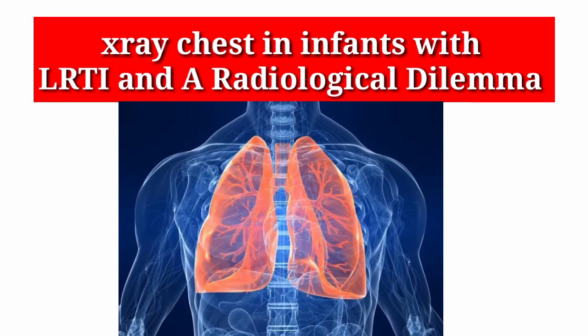So many times we advise X-rays in infants who are admitted or come to OPD as a case of lower respiratory tract infection in our hospitals. A confusion arises while interpreting these X-rays, and I will discuss this with you in this video.